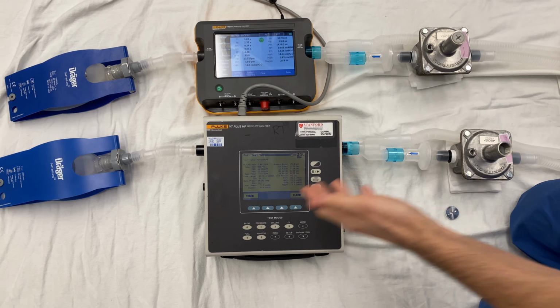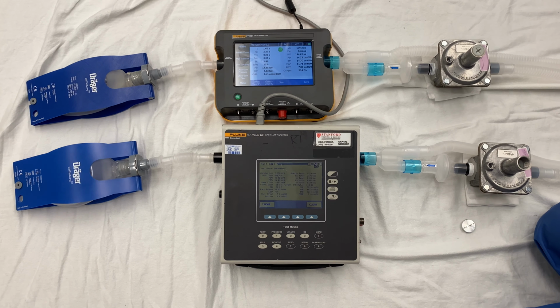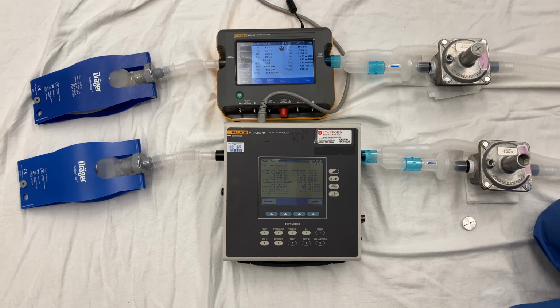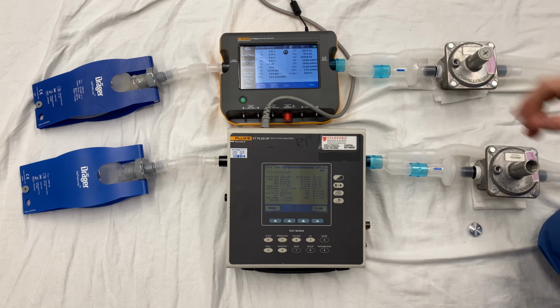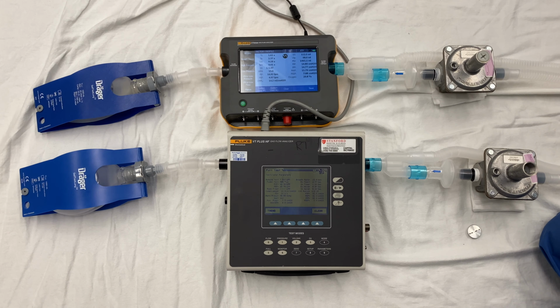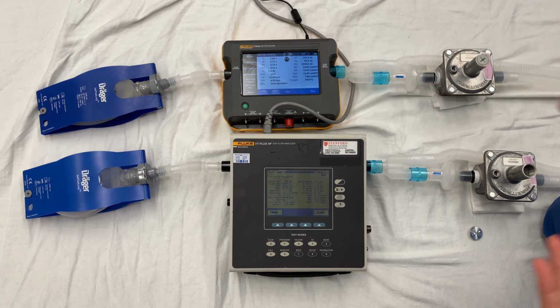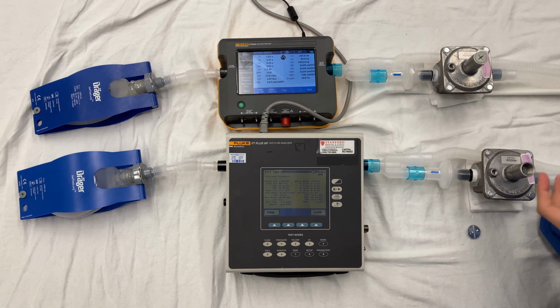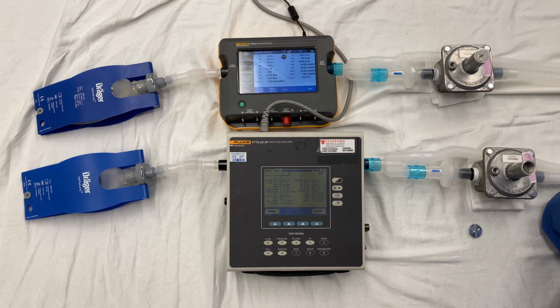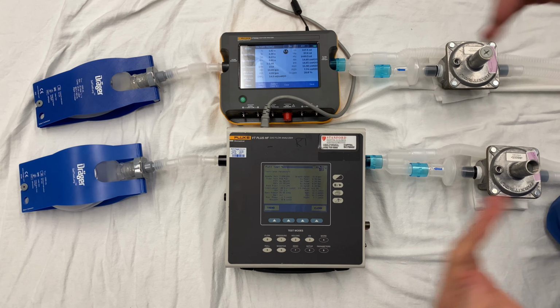So downstream from these pressure regulators, we do have two gas flow analyzers here, which allow us to measure the tidal volumes and pressures that we're delivering to each patient independently. This is very important. You don't necessarily need these specific components, and there are other components which would be cheaper that could achieve the same goals, but you need downstream monitoring because pressure regulators don't have any kind of intrinsic monitoring to give you information about what you're delivering to the patients.